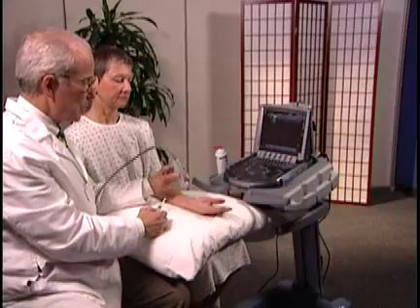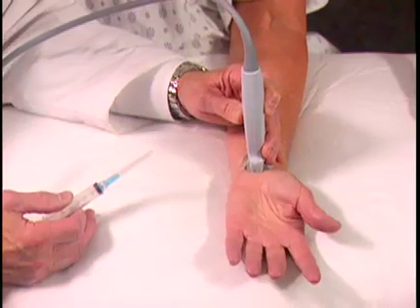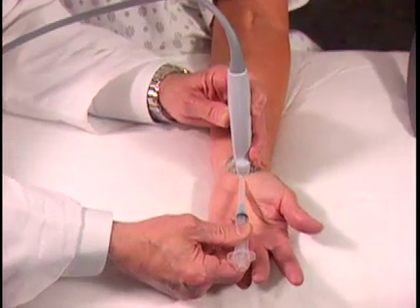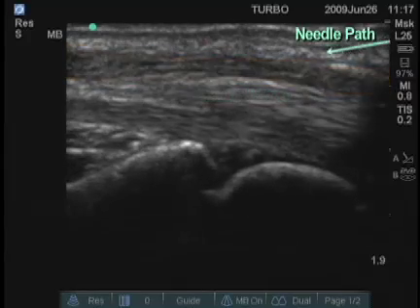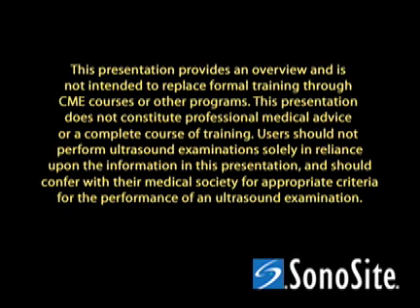The other approach that some people use is with the transducer longitudinal. Here's the median nerve on the screen, and you can approach the median nerve this way — distal to proximal. Here's the median nerve on the screen.